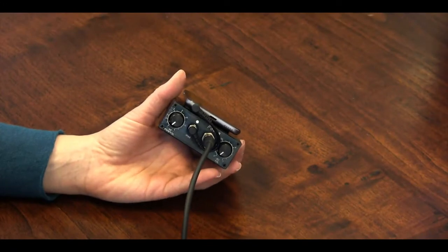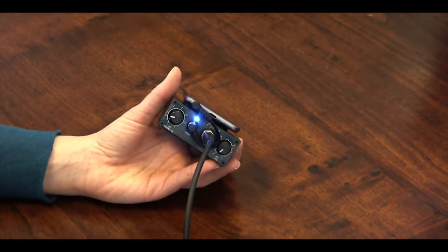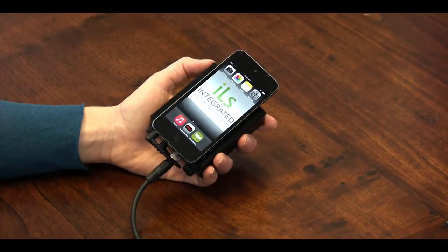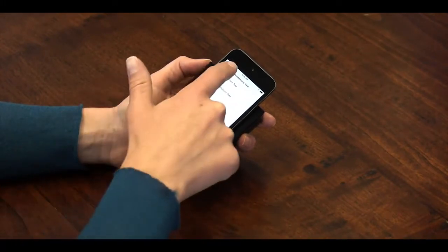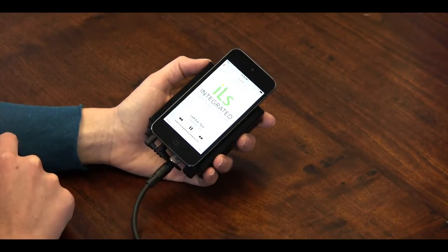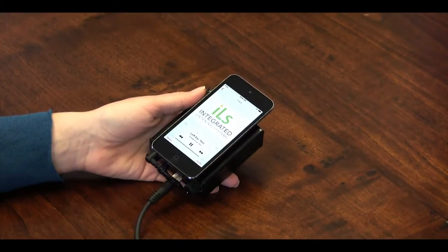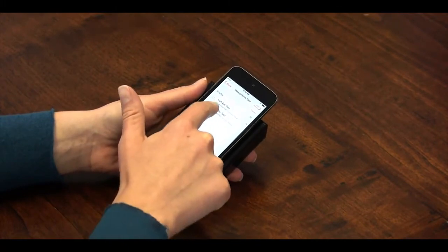Now we'll test that our headphones are working properly. First, let's check the air conduction. Turn on the amplifier and set the volume to 0.5. Take note that your headphones are labeled left and right, then put them on. On the iPod, press the music icon. Select headphone test, then air conduction test. Select left ear test, and music will begin playing in the left ear only. You may need to adjust the AC volume to hear it, depending on your level of sensitivity. Once you have confirmed that the left ear is working, press the back arrow in the upper left-hand side of the screen. Then use the right ear test to confirm that the right ear is working properly.